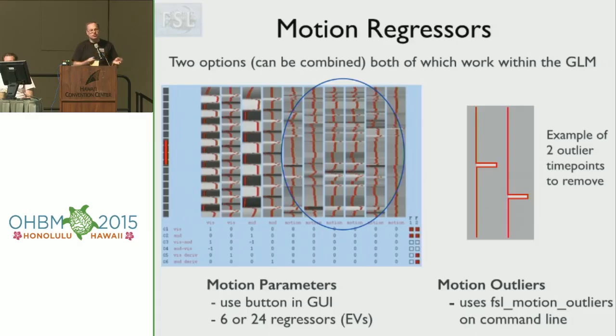We do have a separation between motion correction, which is realignment, and motion artifact correction, where you're dealing with all of the other things which have been induced and locked into your data. You can move them around as much as you want, but they're locked into the actual intensities, so we want to correct for those as well. These are a couple of the techniques you can use to do that. You can put these regressors in, and that's fine as long as you're not doing a task-based study where you've got very strong correlation. If you've got that, then it's a problem, and that will remove most of the interesting information from your data too. So that's why it's an option to be explored, suitable in certain situations and not in others.